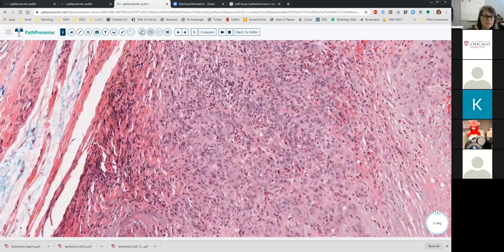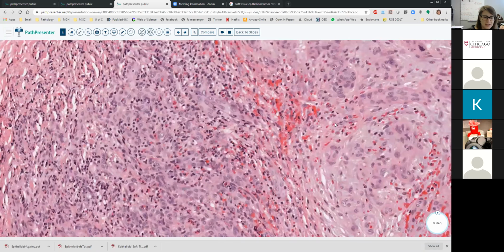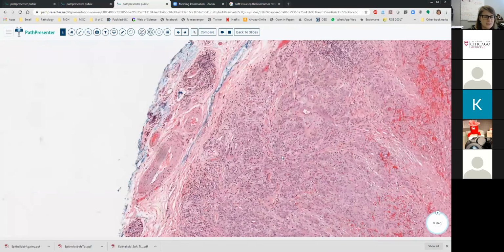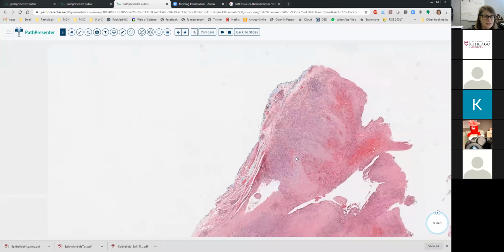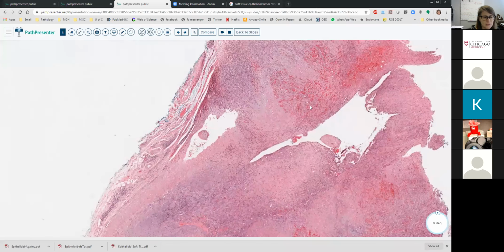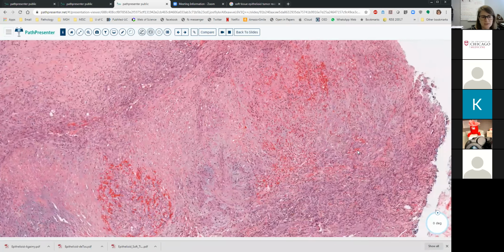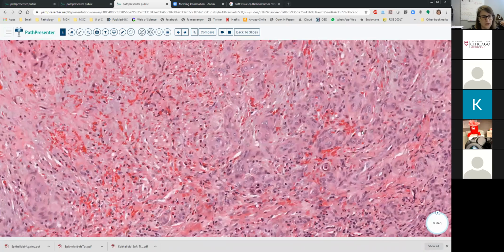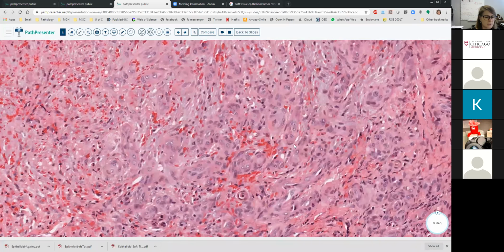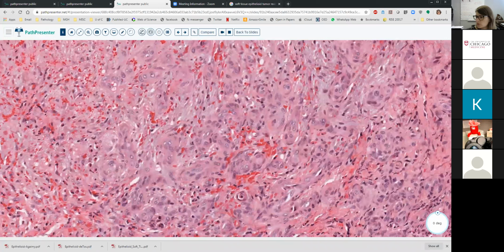They are surrounded by these eosinophils, and they generally don't have other high grade features like tons of necrosis, tons of mitoses, perineural or vascular invasion, things like that. So those of you who voted for epithelioid hemangioma are correct.